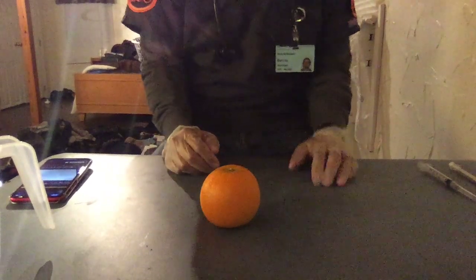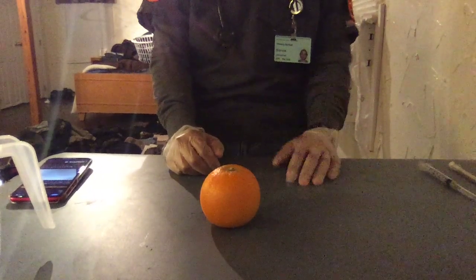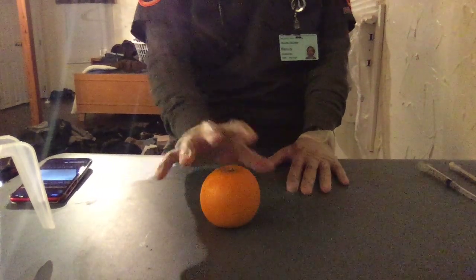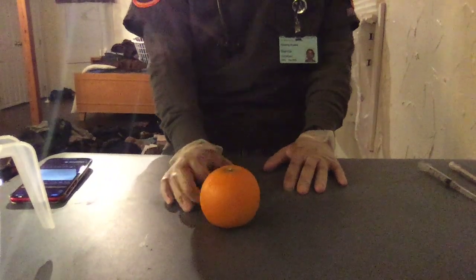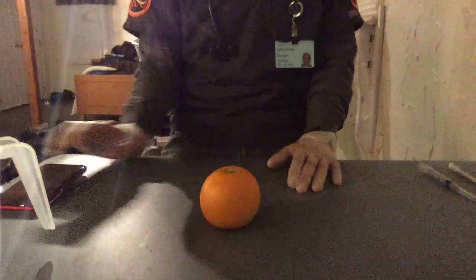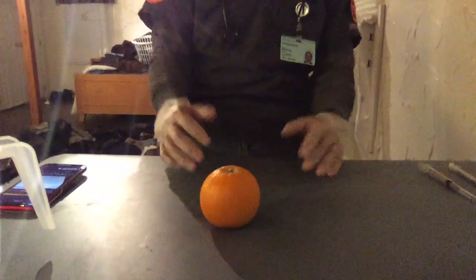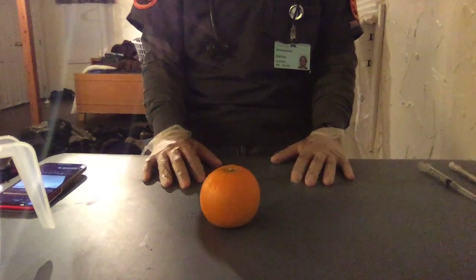I will be demonstrating 3 different injections, actually 2, and explaining the third one. The 2 that I will be demonstrating with this orange are the intramuscular (IM) and subq, subcutaneous injections, and the intradermal is a little bit different. So I gather all my materials.